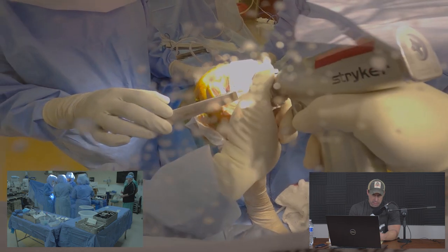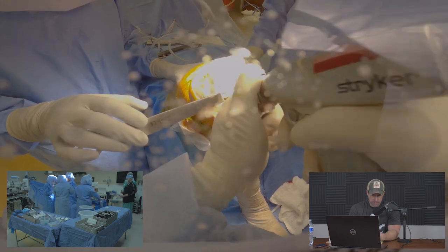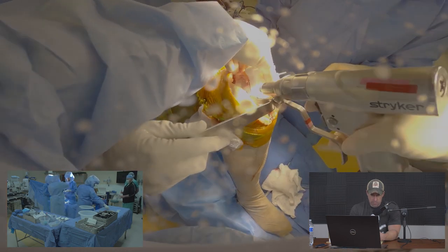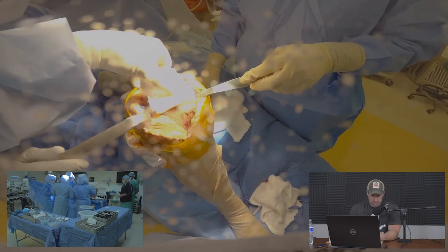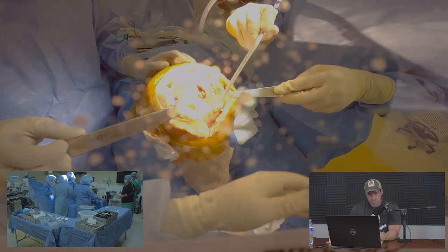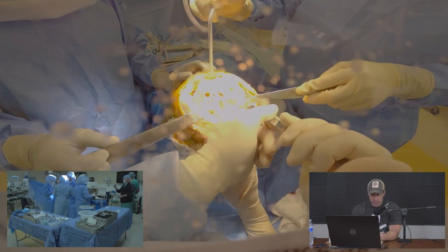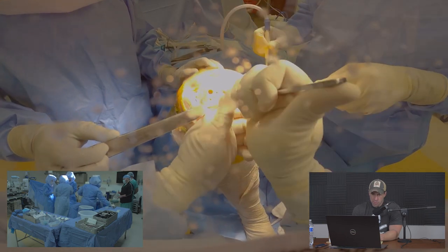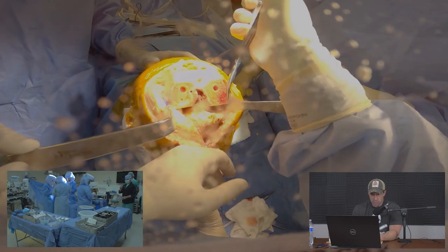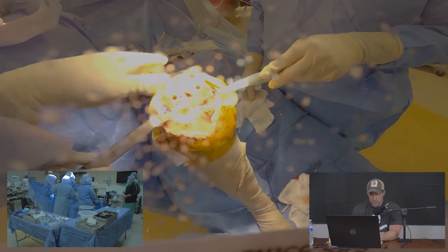In most systems the femoral block has four cuts: anterior, posterior, and two chamfer cuts. This particular block has an anterior cut, one chamfer, and a posterior cut. We then apply yet another block — this is a little different from conventional systems because it has an extra set of chamfer cuts. I'm taking away some residual bone during this step.